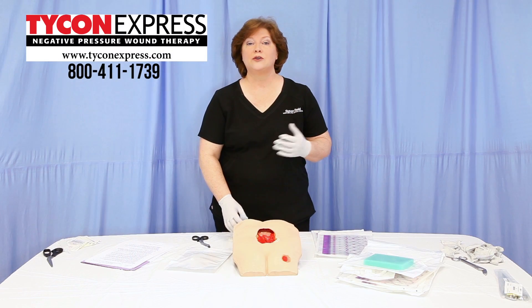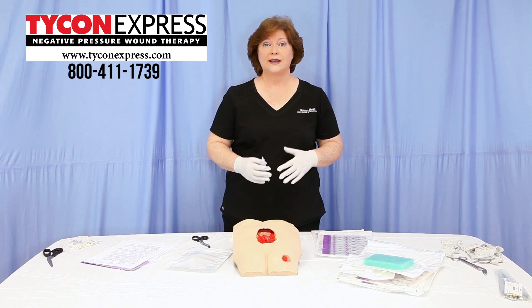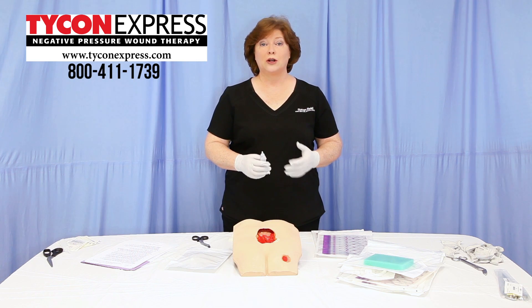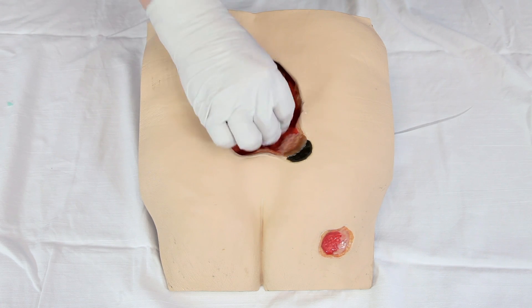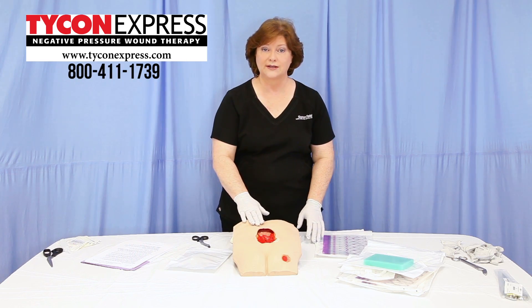When preparing to do the dressing change, you'll follow the standard wound dressing technique of removal of the old dressing and discarding using universal precautions. Thereafter, you will cleanse the wound, blot any excess dry, and assure that the perimeter of the wound is cleaned as well.